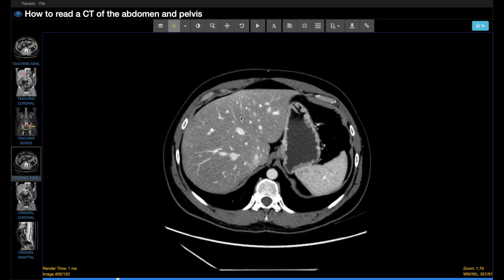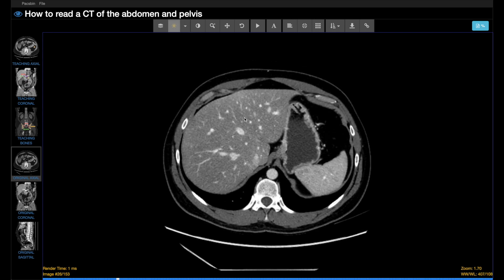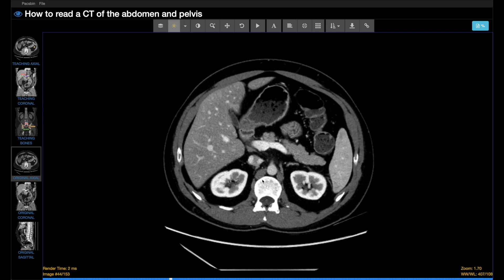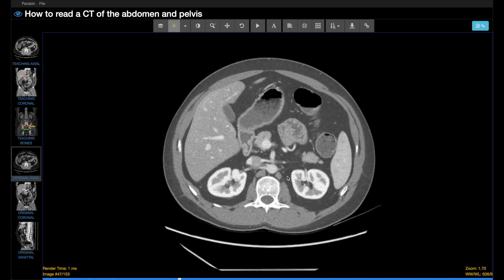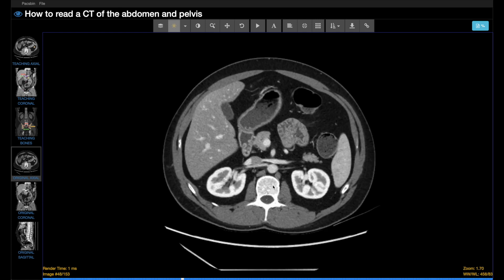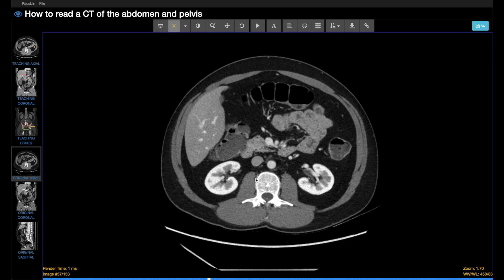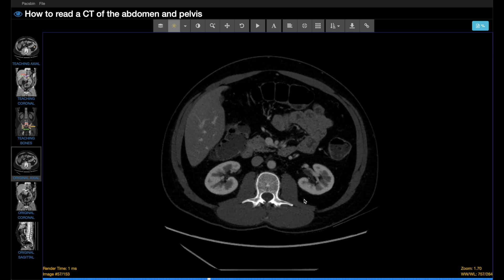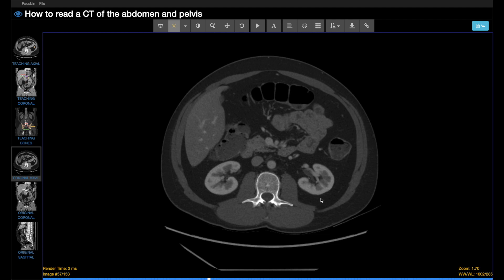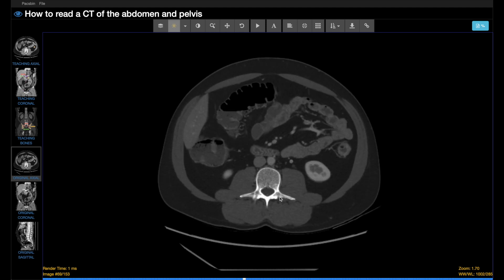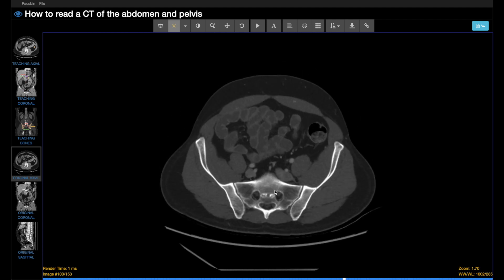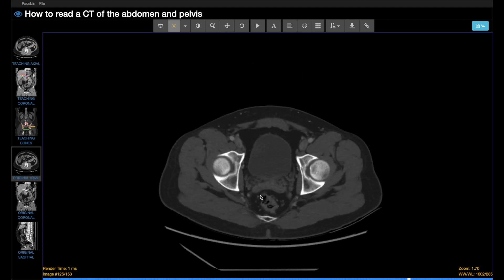We'll go back to a more standard window and show, for example, if we want to look at the spine, the bones are very bright and white and difficult to see the definition, so we widen that and use more of a bone window to evaluate the osseous structures.